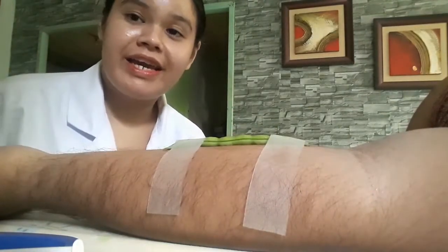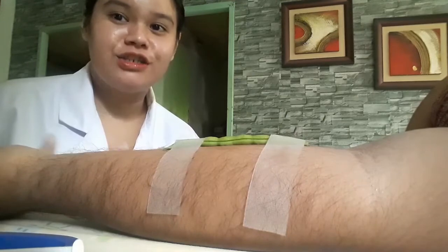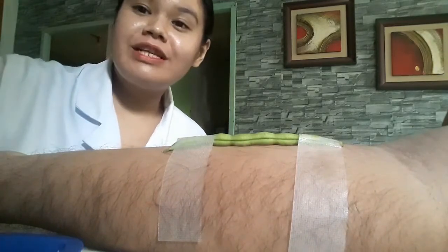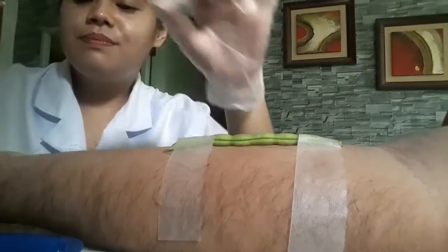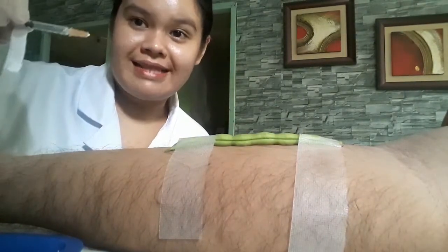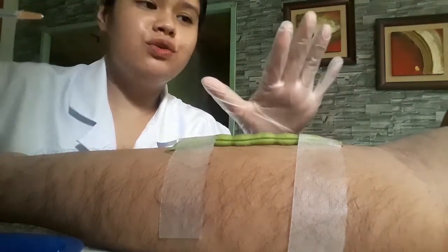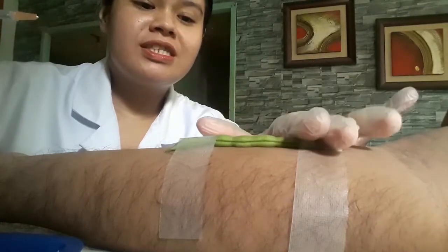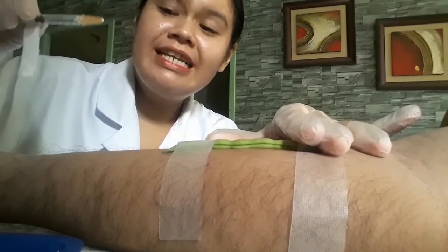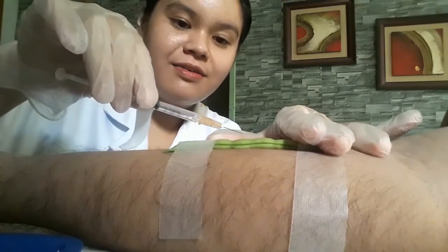After applying the antiseptic, let it dry, but remember, do not blow, just let it air dry. Now we will get our syringe and remove the cap. Hold the syringe with your forefinger and your thumb with your dominant hand. With your non-dominant hand, use your forefinger and your thumb to stretch the skin down at the injection site. Now, bring the needle closer to the patient's skin at a 5 to 15 degree angle.